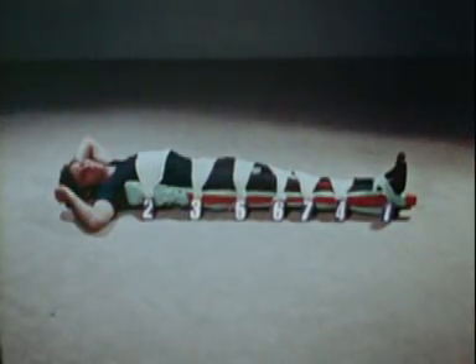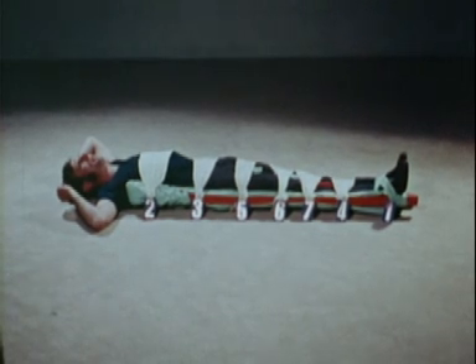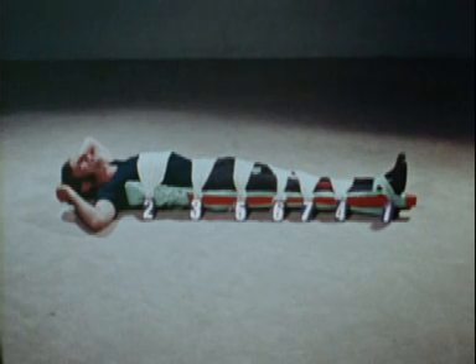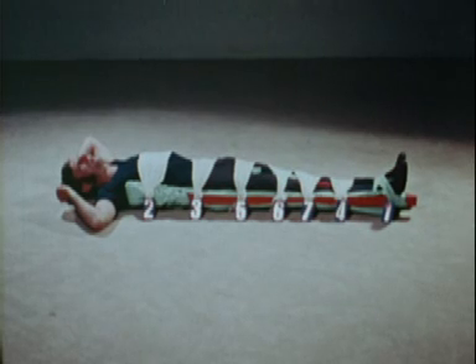Immobilization is completed by tying the other bandages to the splint in the following order: number three, round the pelvis at the level of the hips; number four, round the calves; number five, round the thighs above the fracture; number six, round the thighs below the fracture; number seven, round the knees. The patient is now ready to be transported by stretcher, but watch out for the appearance of shock.